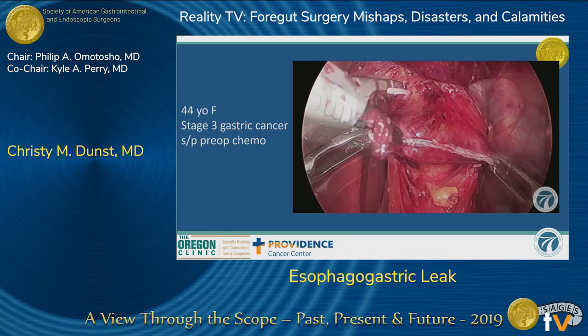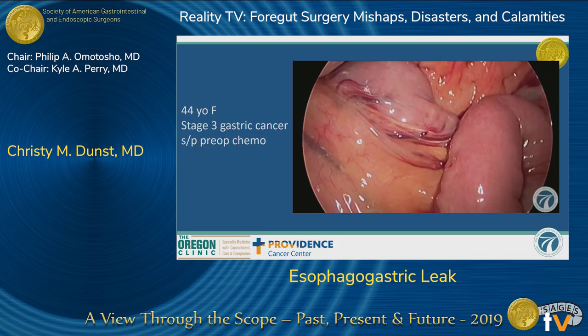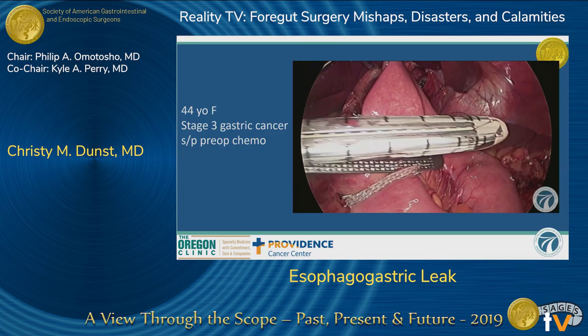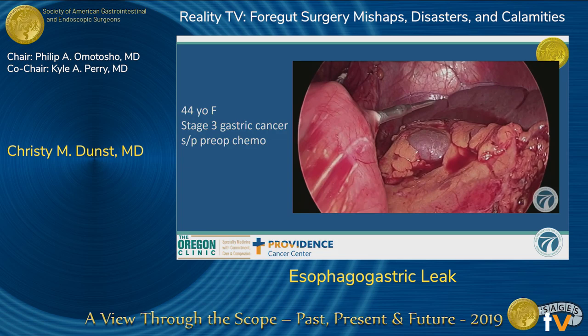I like to use the Orville for the esophago-jejunal anastomosis. When I pull the plastic piece through, I cut it like this because I've had them fall back in the esophagus before — just a little trick. Then I can leave it sitting there while I go ahead and find my jejunal limb, find a piece that's going to come up nicely. Do your division. I like to cut the mesentery on the roux limb pretty aggressively because you're going to cut it off anyway, and if you can make it look ischemic, if you drop the two limbs you'll always make sure you pick up the right one.